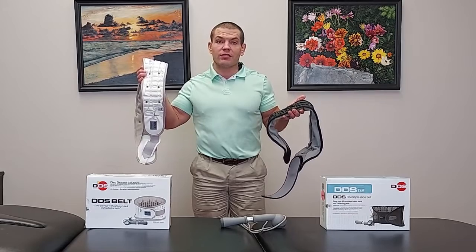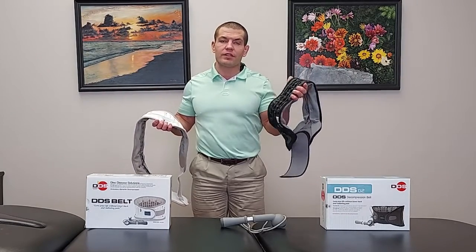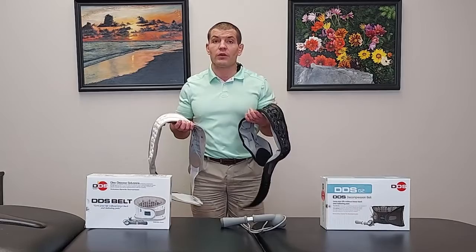The DDS-300 was the original model. The G2 is a newer, updated version, but there are some differences between the two. For the most part, they're both good braces and they help unload your spine.